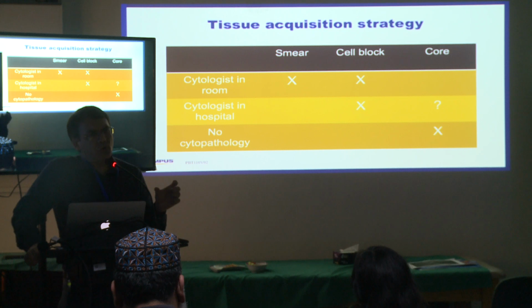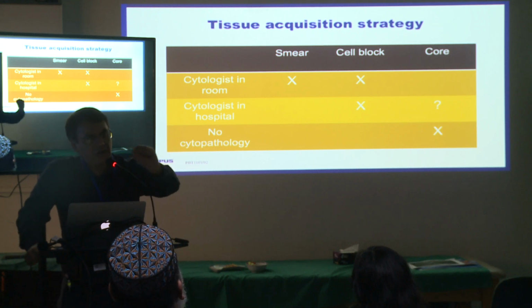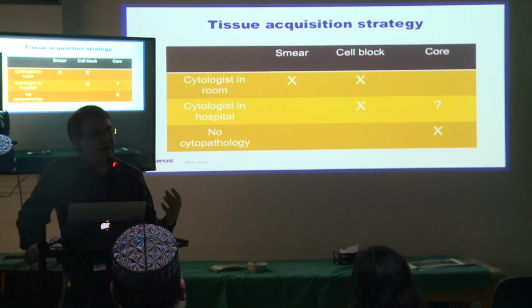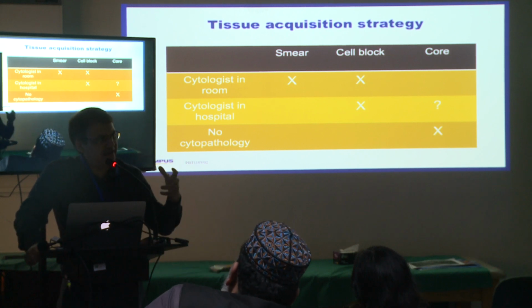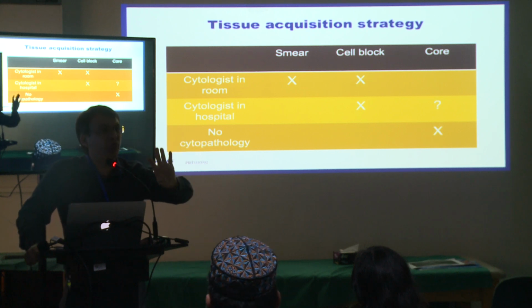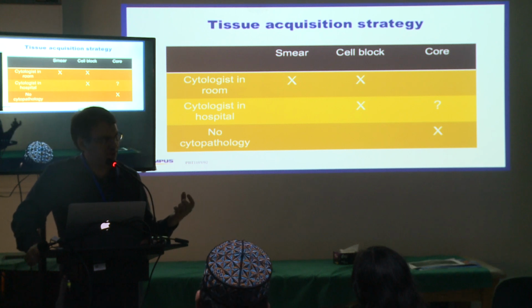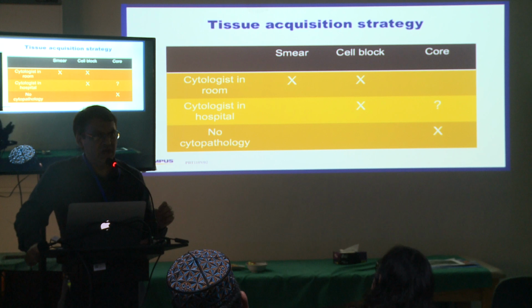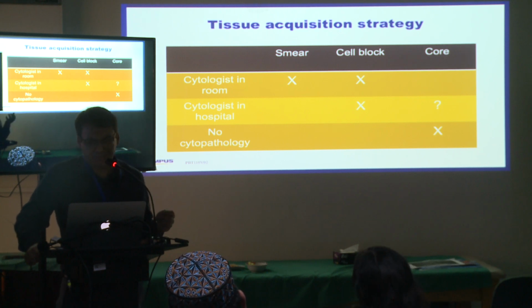When you are getting a core tissue, it's a long thread that you are looking at. Just make sure it's not all red, as that could be a clot. So you need to sometimes break it a little bit. Just make sure that there is some white-looking tissue in that, because that would be the real core, especially if you have to send it outside. So just make sure there's some white tissue in the preservative.